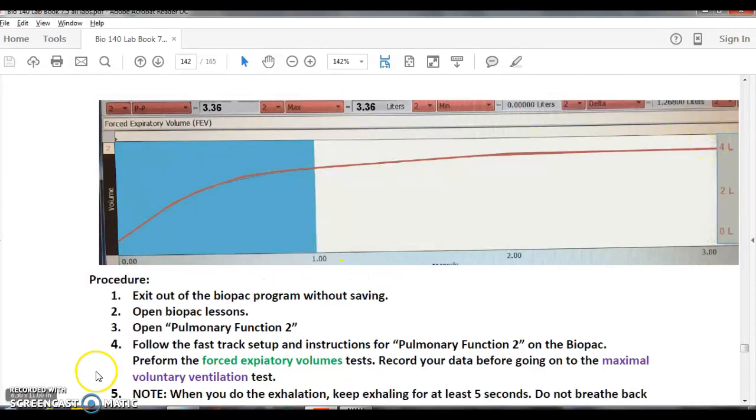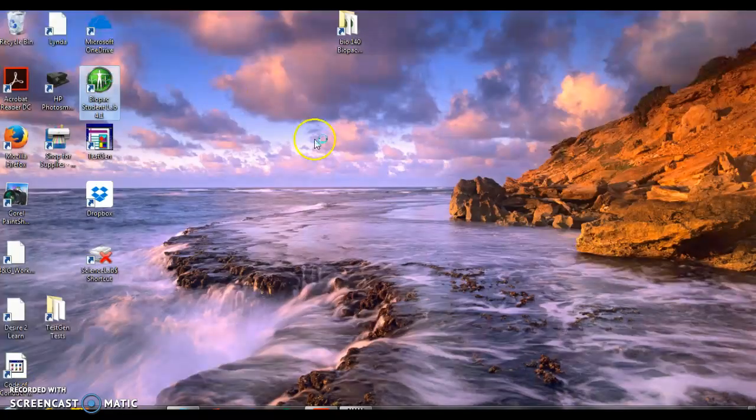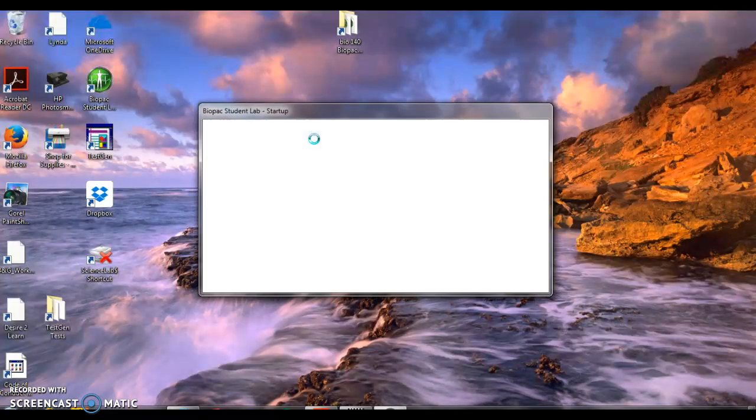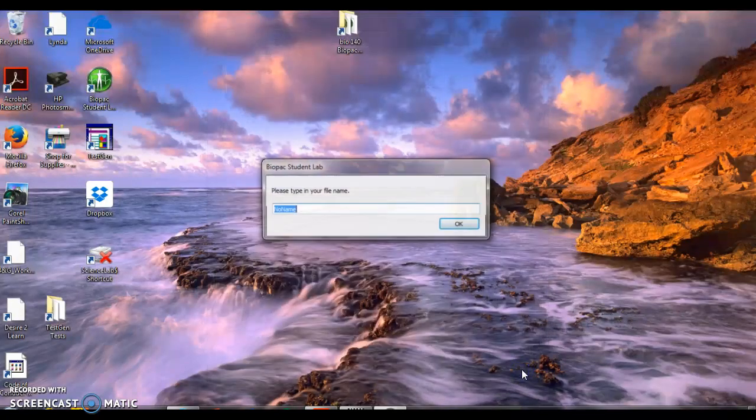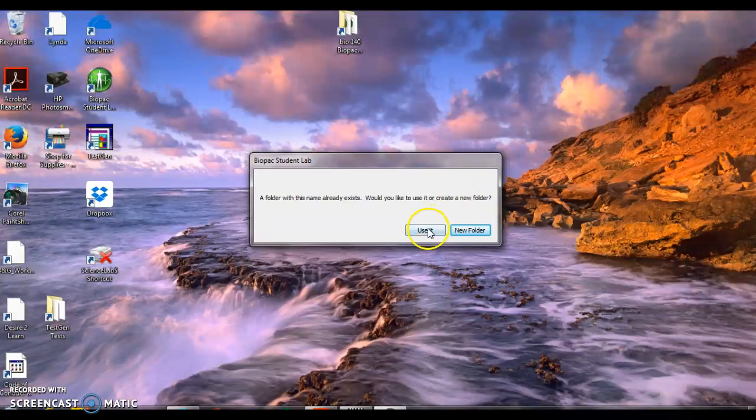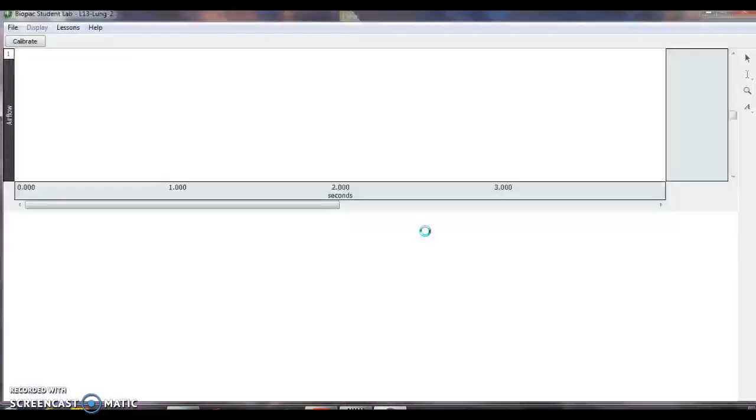So you're going to open BioPack, and you're going to pick Respiratory Function Test 2. So I'm going to pick Pulmonary Function Test 2, press OK. And I am John. Yes, I would like you to use it.